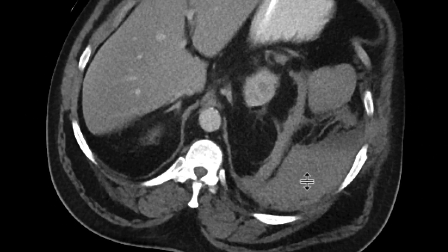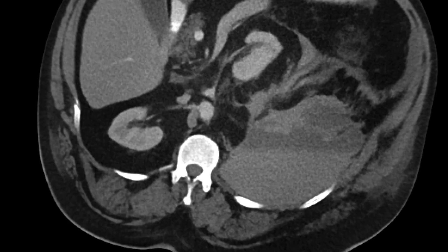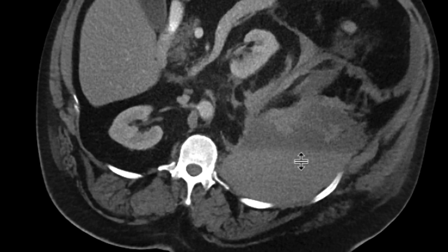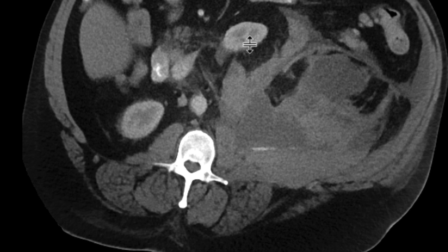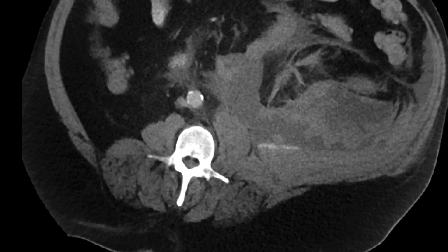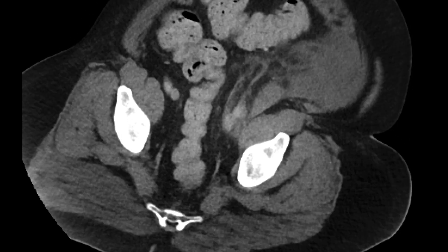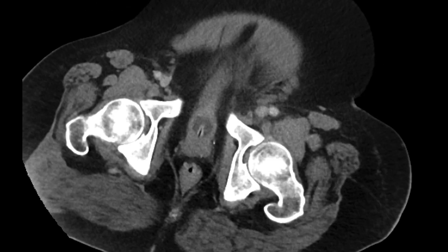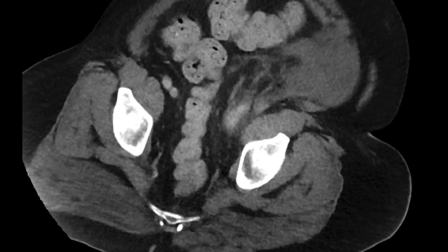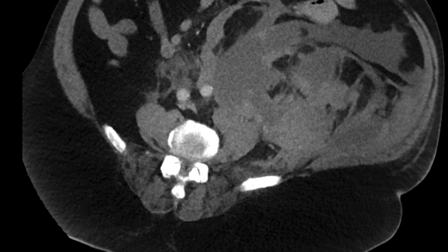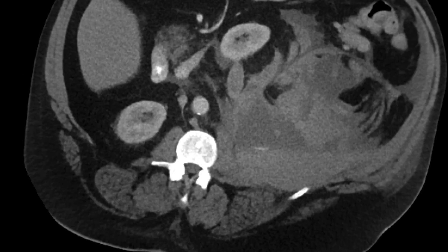We can see quite immediately in the retroperitoneal space on the left a large collection. There's a fluid hematocrit level within it. Look how it's displacing the left kidney and other structures anteriorly and towards the midline. It goes all the way down along the left retroperitoneal fascial planes to the pelvis. This is compatible with a large retroperitoneal hematoma.